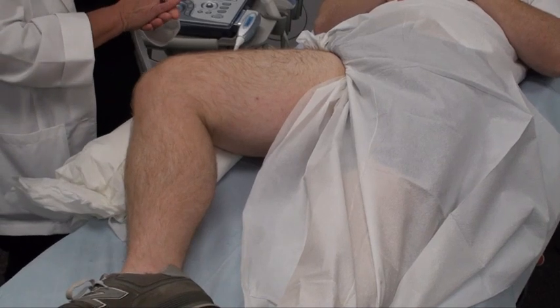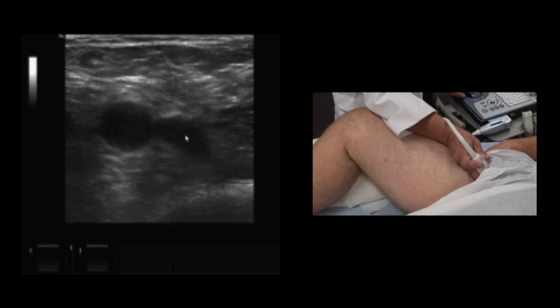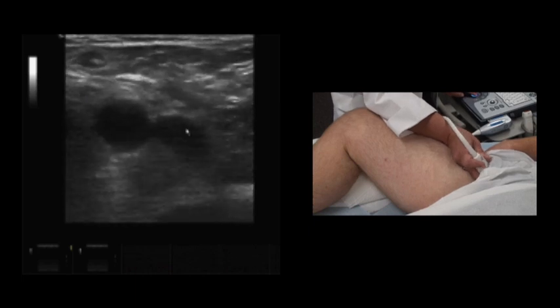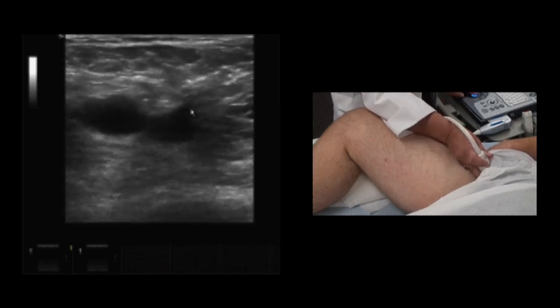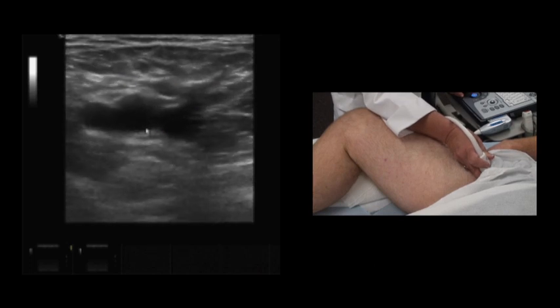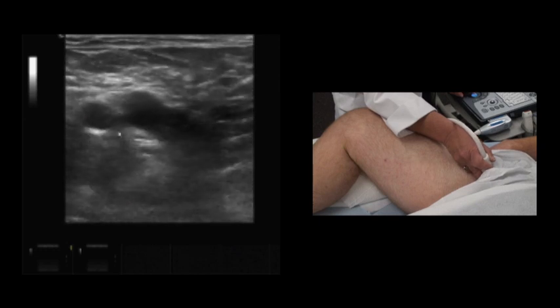is thrombus. We're beginning at the level of the groin in this transverse orientation with the transducer notch pointing towards the patient's right. Here we have the common femoral vein and the common femoral artery, and the common femoral vein does completely compress. As we scan inferiorly, we see the takeoff of that greater saphenous, and we also see the takeoff of the profunda artery in this location.